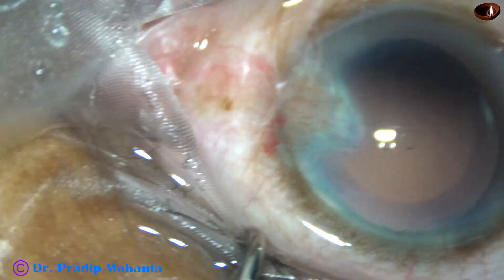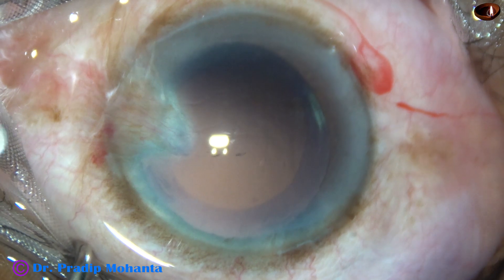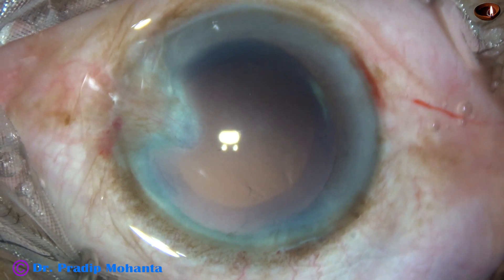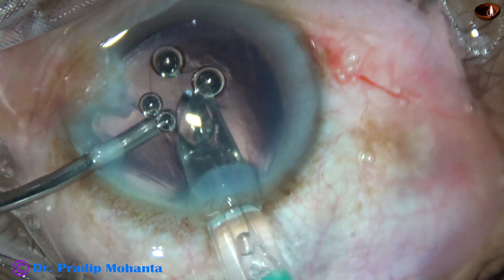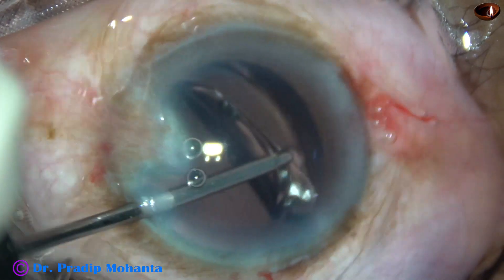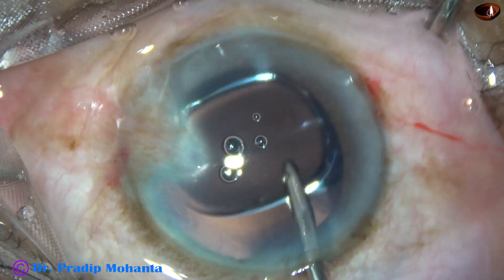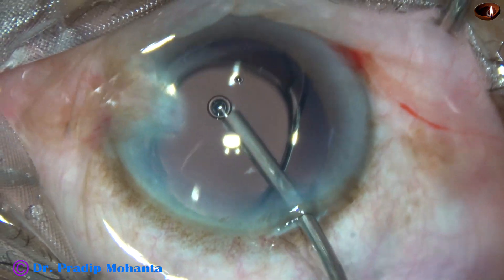The cortical cleanup is complete, and now I am going to enlarge the main wound a little bit because I am going to use a bigger cartridge. Sometimes if we don't enlarge the main wound, the lens may get stuck at the wound and the wound gets very much stressed. If we enlarge the wound a little bit, the tip of the cartridge goes in and the IOL is delivered inside the anterior chamber. The intraocular lens is placed in the capsular bag. It is a hydrophobic material and it is opening slowly.